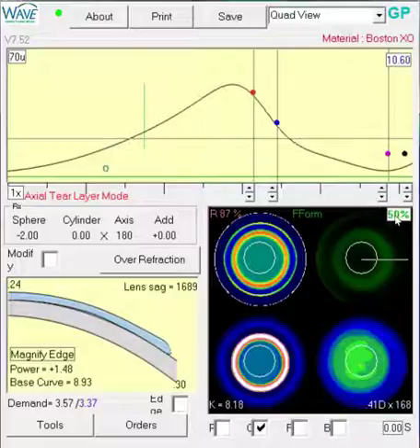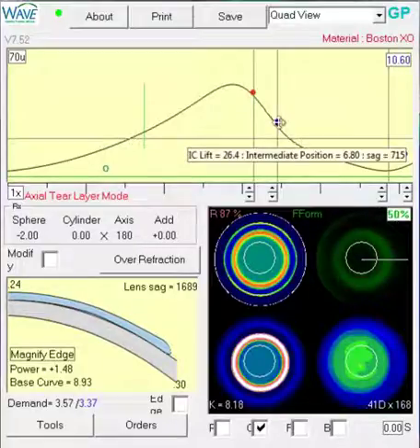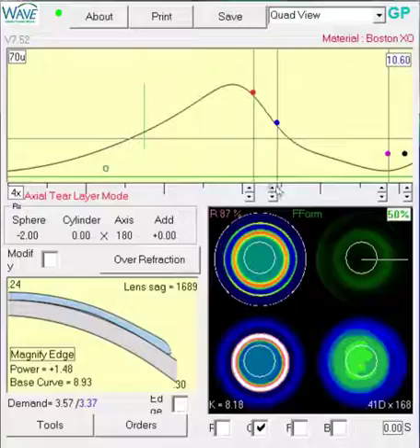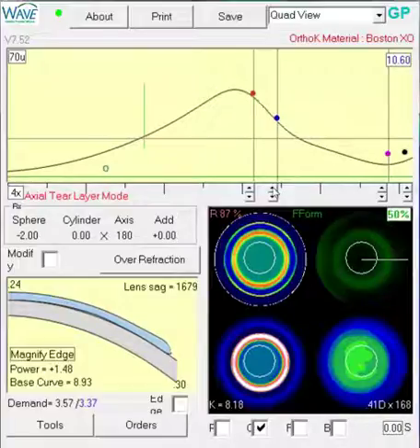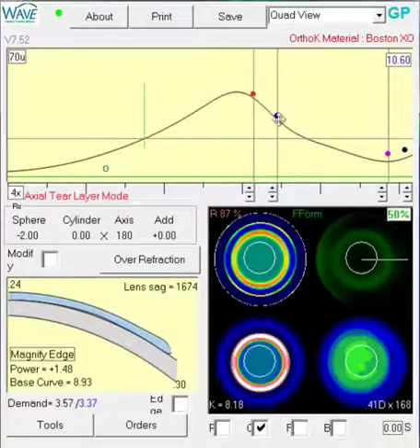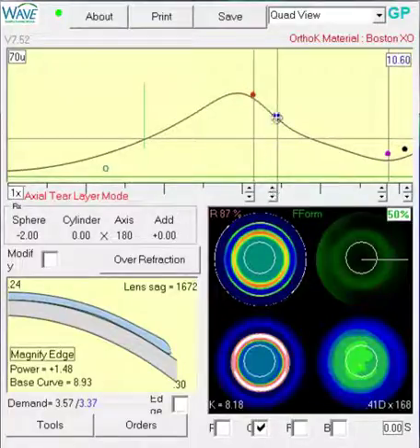So we're going to do this in 50% mode, and what you want to do is hover over here where the lens touches down. Right now we're at 715. Let's aim for 12, and so that'll give us a new target of 703.